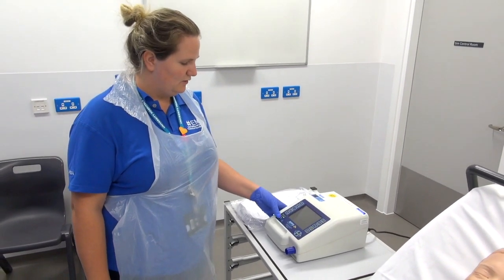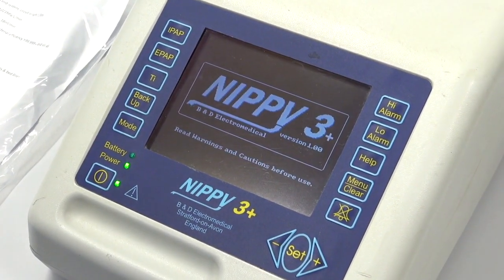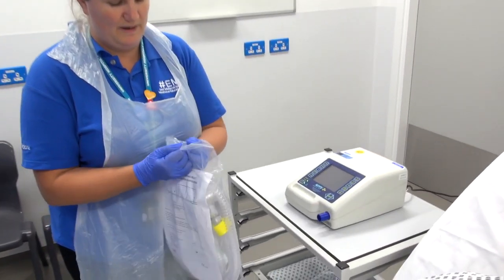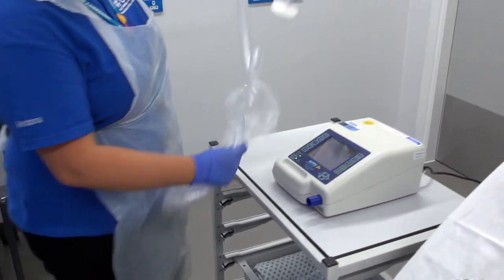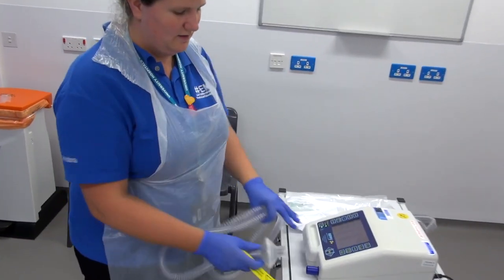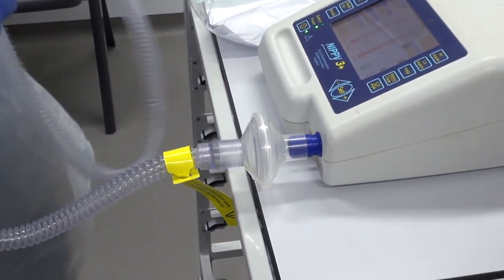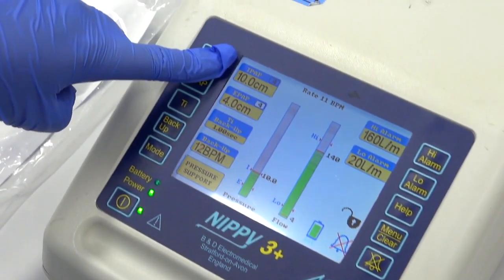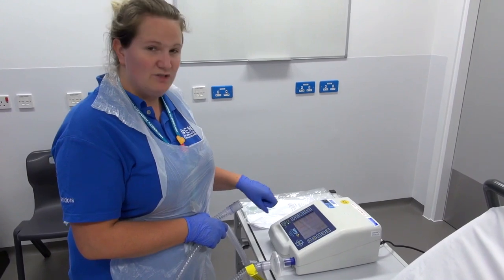To set up the NIV machine, we first need to turn it on by pressing the power button. We then take the tubing with the filter attached out of the bag and attach the filter end to the machine. We then need to check that all of the settings are correct. In our department we start with an IPAP of 10, an EPAP of 4, and a backup respiration rate of 12.